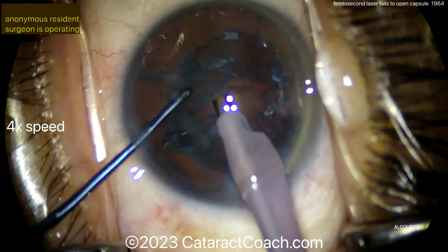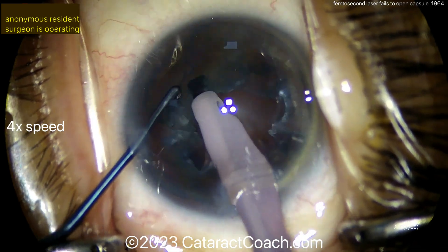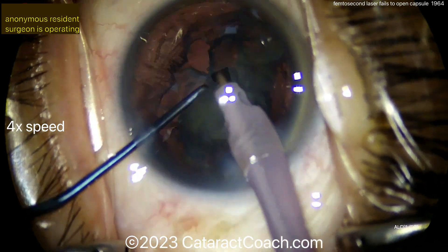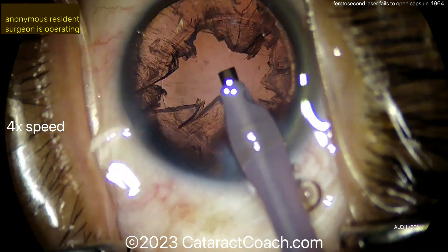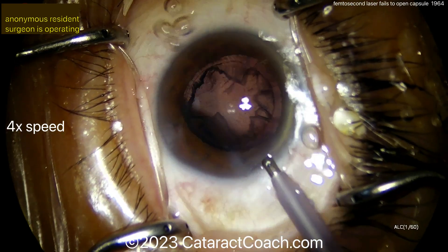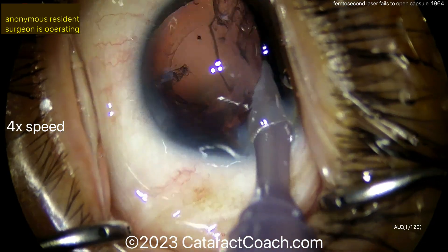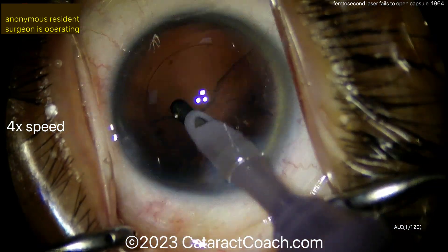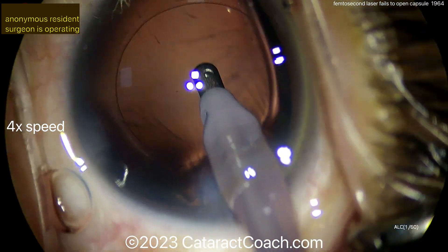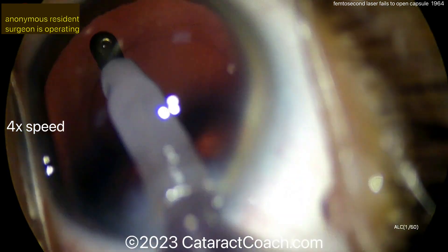You want to put as little stress as possible on that capsule. Femtosecond lasers are great — I want you to have all the tools in your toolbox — but don't be reliant on any machine. You want to be reliant on your hands and your surgical judgment; that's what's most important because no machine is perfect and sometimes they break down. On cortex removal, do the area of the previous laser treatment last — do the other areas first — just in case there's some capsule weakness where the IA probe might inadvertently grab and zip through, ripping the capsule.